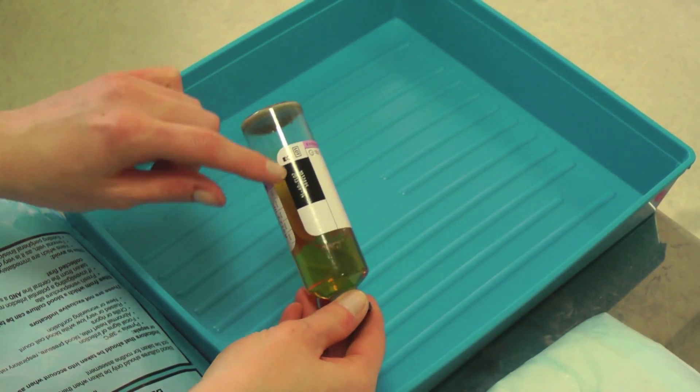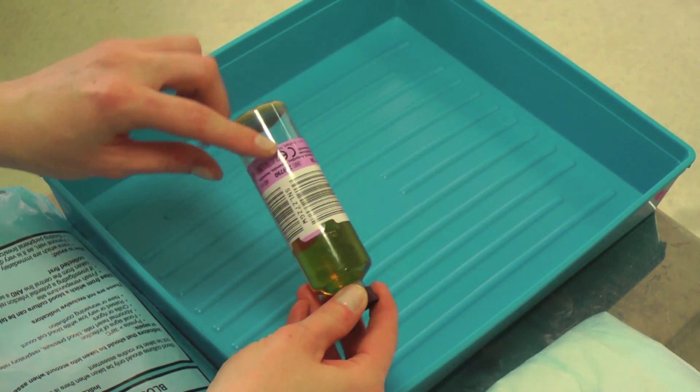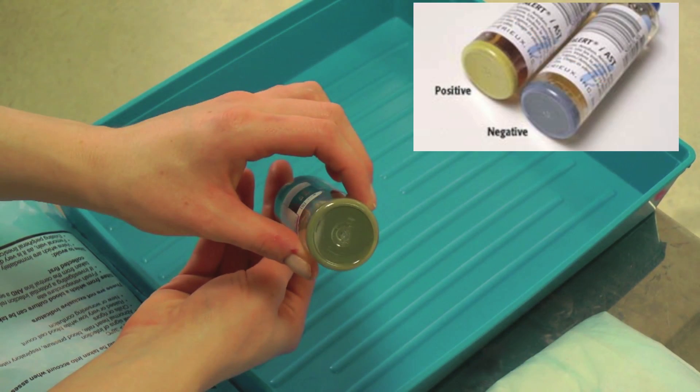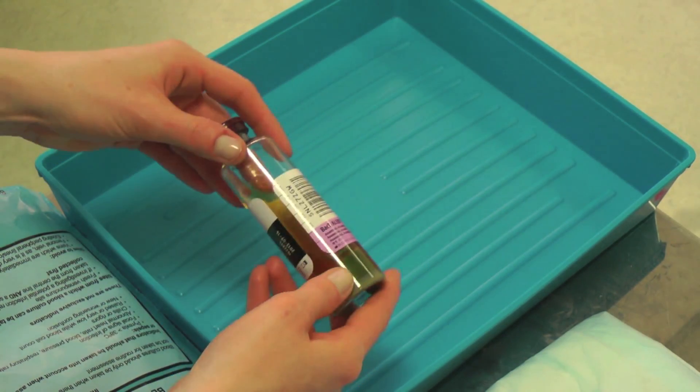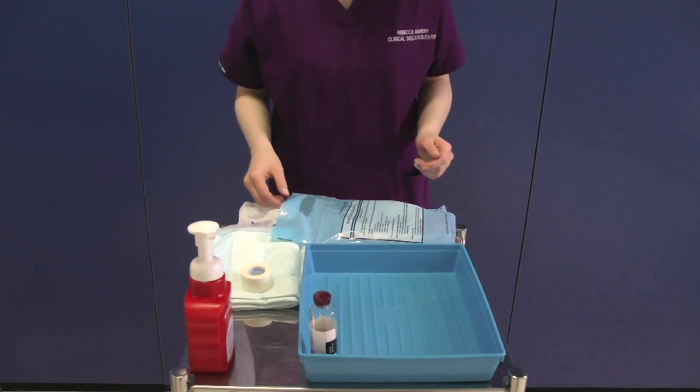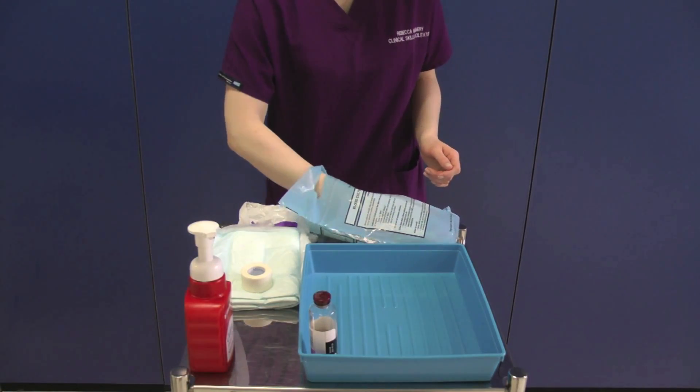Check the expiry date on the blood culture bottles. There is a barcode that must not be removed. Also check for contamination, which is indicated by yellow discolouration on the bottom of the bottle. There is a millilitre scale on the side of the bottle to help you take the correct amount of blood. Repeat this process for the other bottle.